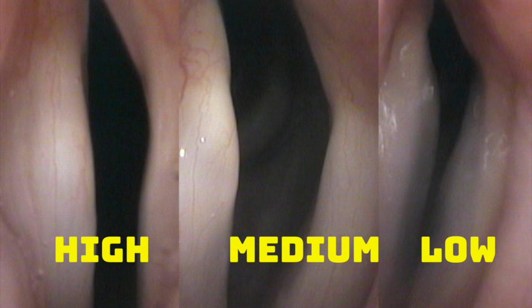because there's compensation from the cricothyroid muscle. At high pitch, we're getting pull, and they'll be somewhat close together, but we can see the angulation of the left side out. As we drop down in pitch, the left side falls out further and further, but also the right side goes over more and more as we drop down in pitch. And that's why a person who has a minor injury of this can be good in the morning and bad in the evening. The compensatory side has been working hard all day.